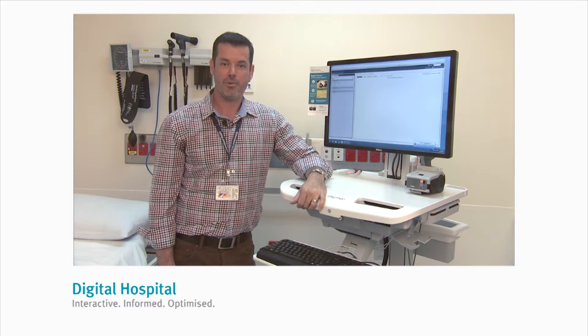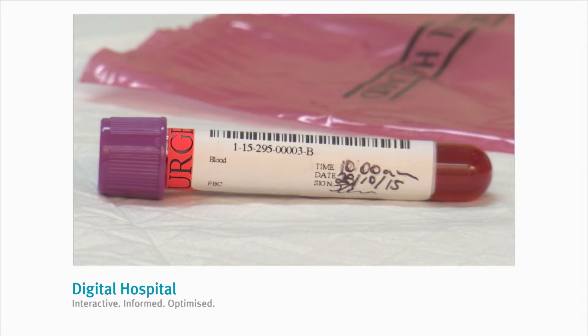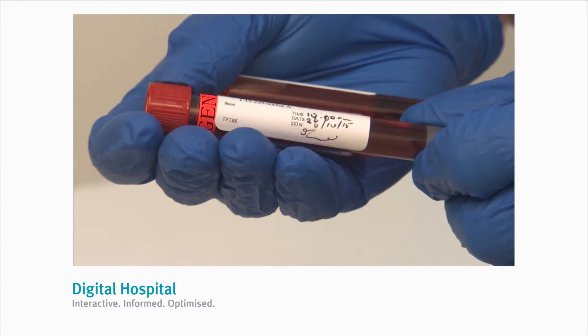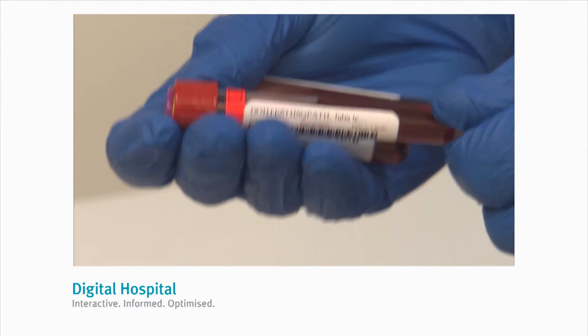Now let's cover the procedure for labelling the specimen tubes. It's really important that this happens without leaving the patient's bedside. Now that you've collected the tubes, complete the labels with the collection time, date, and sign each tube. Label all the tubes ensuring that the correct label is applied to the correct coloured tube.